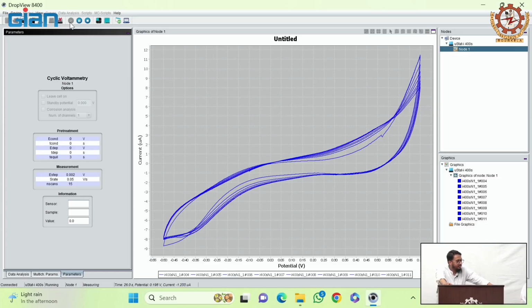So if you remember, until now we are using the platinum based external counter electrode, but once our functionalization step is over, we will be using the PCB based counter electrode. So, until now we are using the reference electrode which is on the PCB, working electrode on the PCB, but counter electrode external. But now we will be in the calibration phase, we will be using the counter electrode on the PCB. So, when you are doing it in the field, let us say you are going to test glucose using this sensor, then you will be using all the electrodes that are on the PCB.